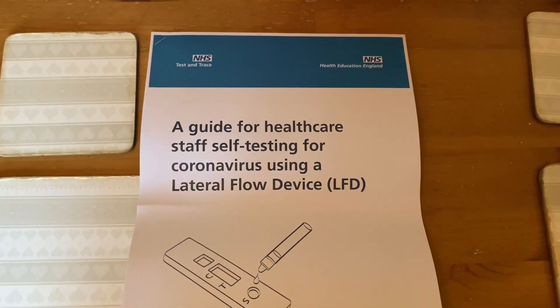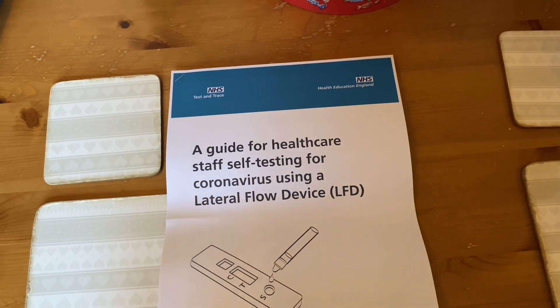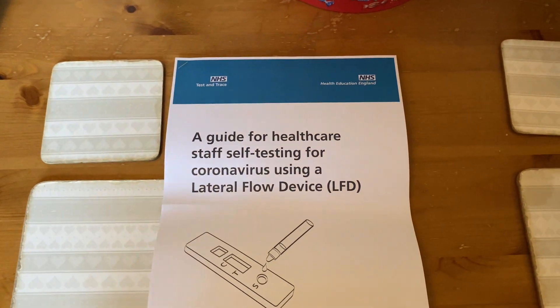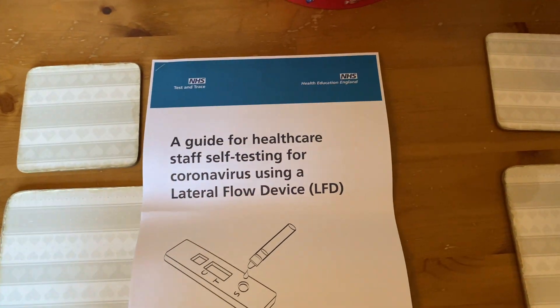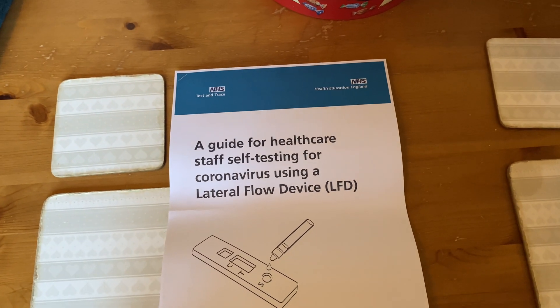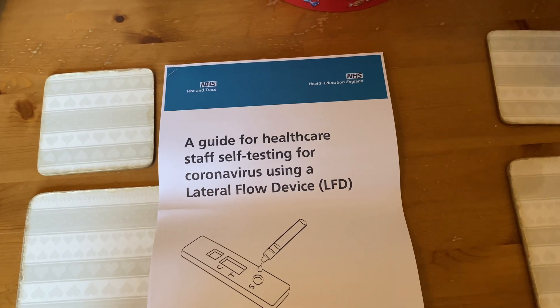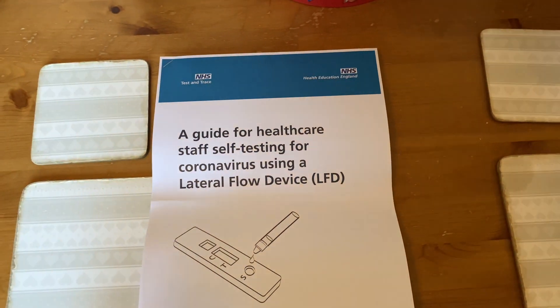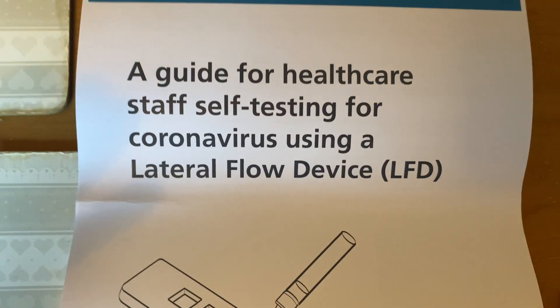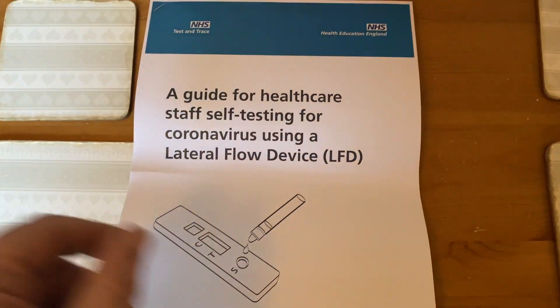If you do a bit of research and go on the government website, that's why that test wasn't working — if you use it on the throat it doesn't work. The people who keep saying 'use your throat' are putting people in danger, because it specifically says don't use it on your throat. The link in the notes takes you to the government website. This is the official guide from the NHS, and I do work for the NHS, so I actually know what I'm talking about.